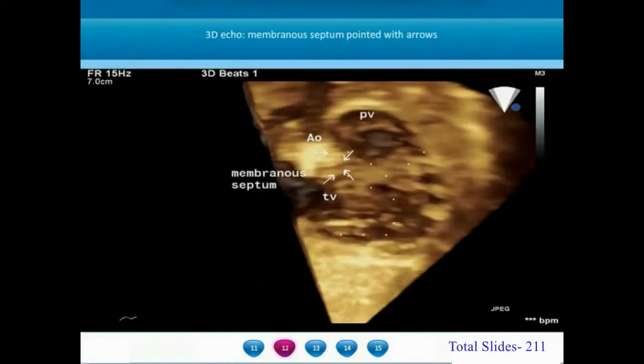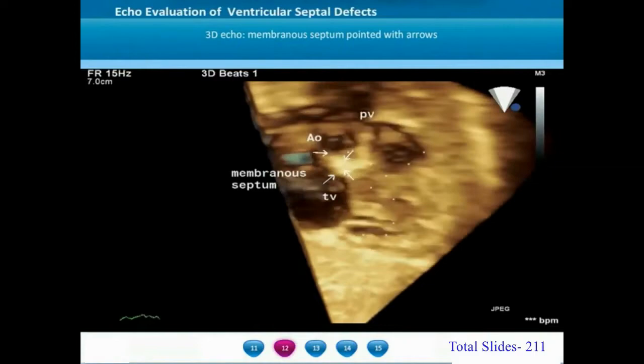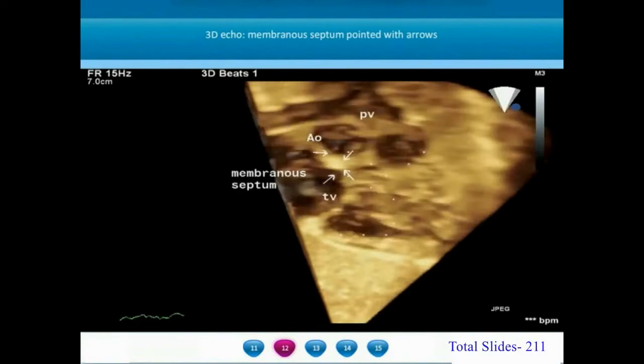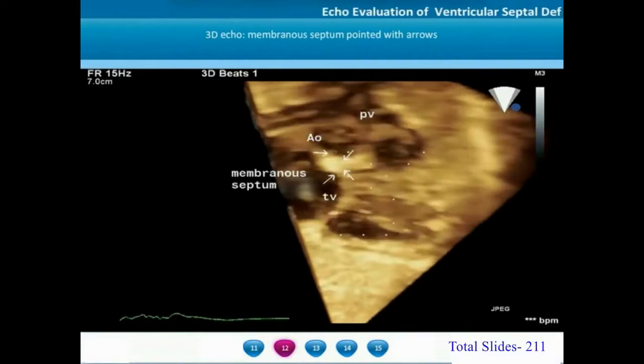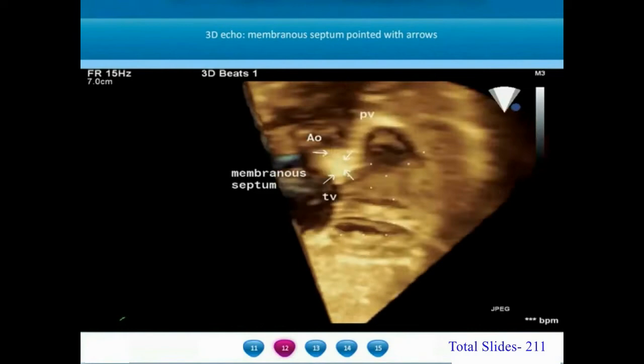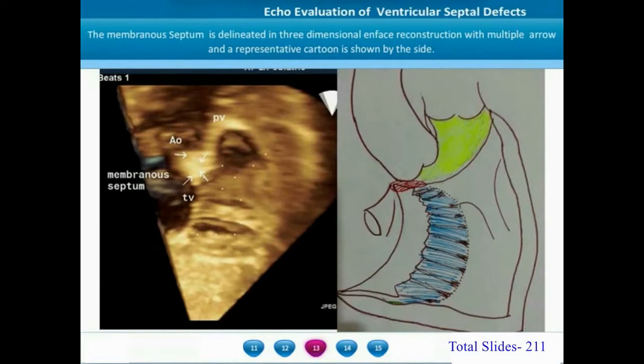On 3D echocardiography, the volume-rendered right ventricular septal surface shows the membranous septum pointed out by four arrows. The inlet and outlet ventricular septum extents are also marked with dots. On a still frame, the membranous septum is clearly identified, corresponding to the region colored red on the adjacent cartoon.